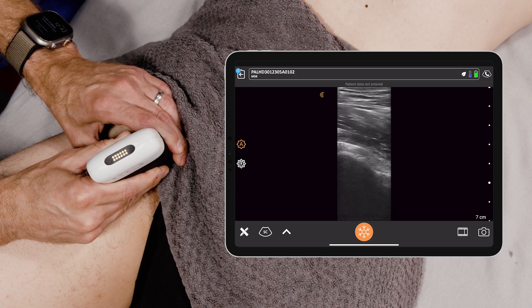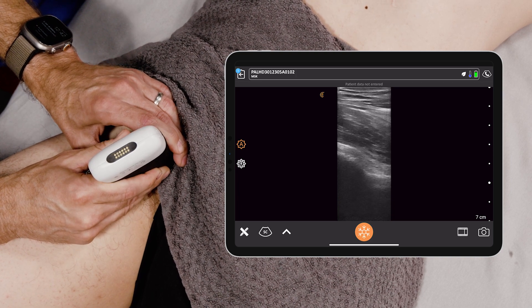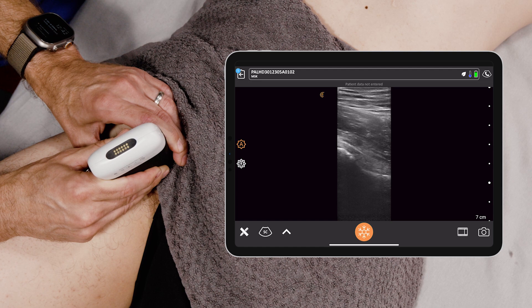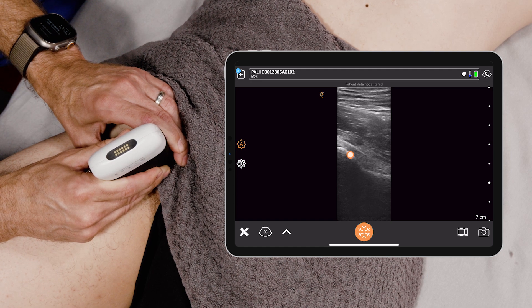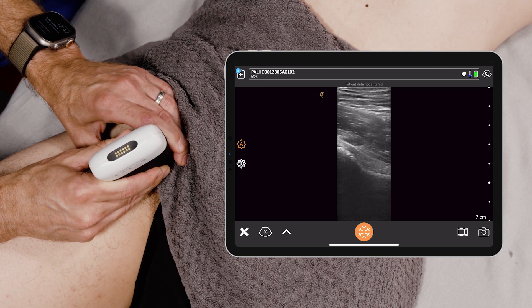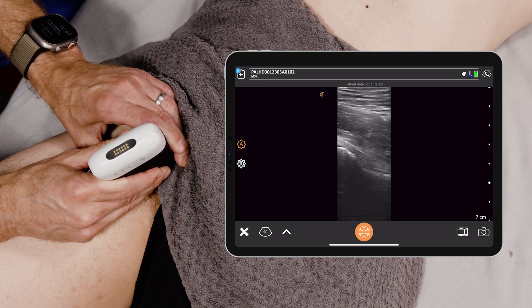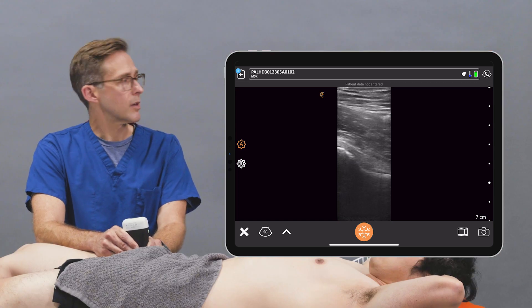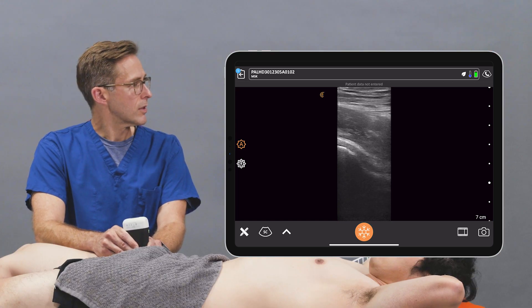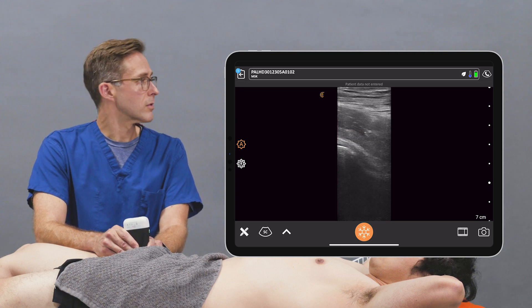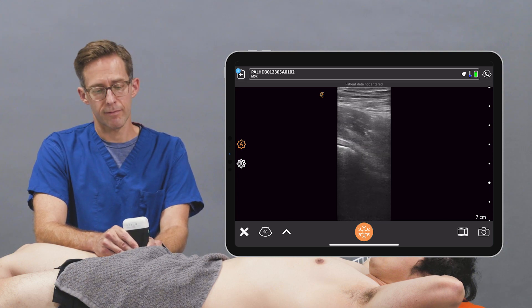Typically if there's an effusion you'd see hypoechoic fluid within the joint space. This could be an indication for an arthrocentesis, further imaging, or at least thinking about a potential septic hip or effusion as a cause of the patient's hip pain. Check all of the areas.